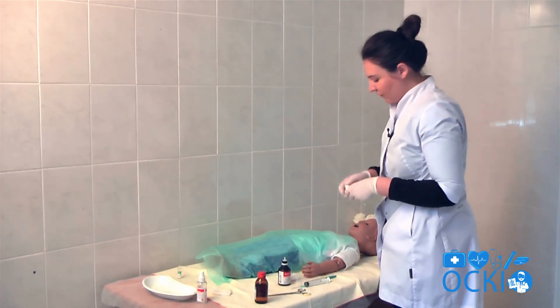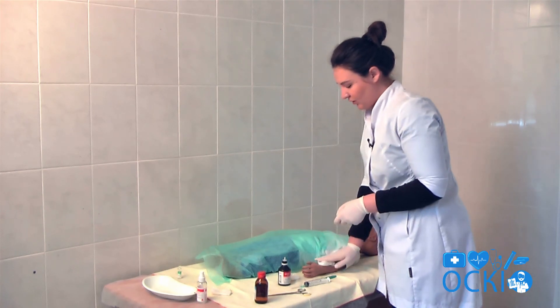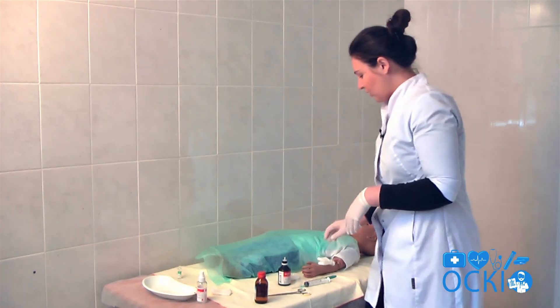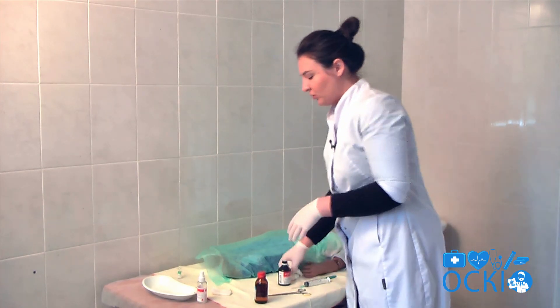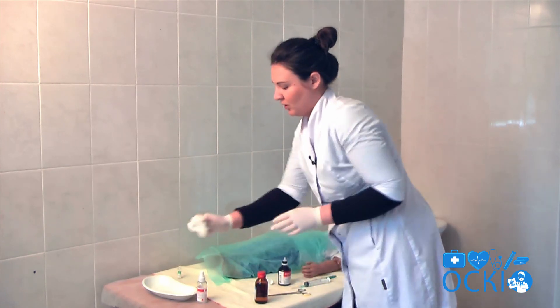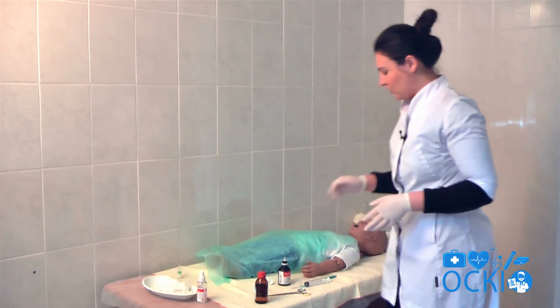After applying a sterile dressing, put all tools and materials in the container. And that's all.